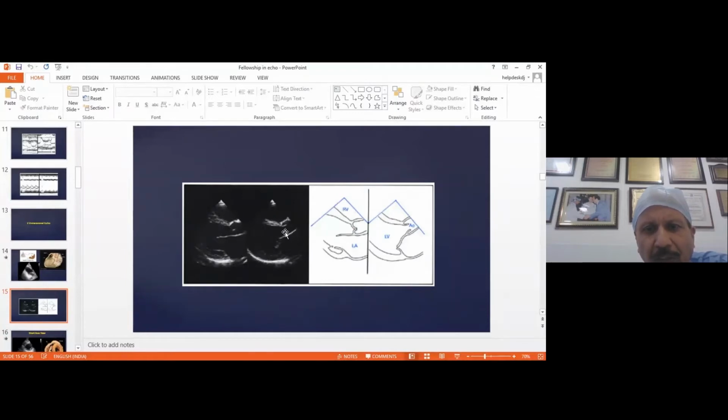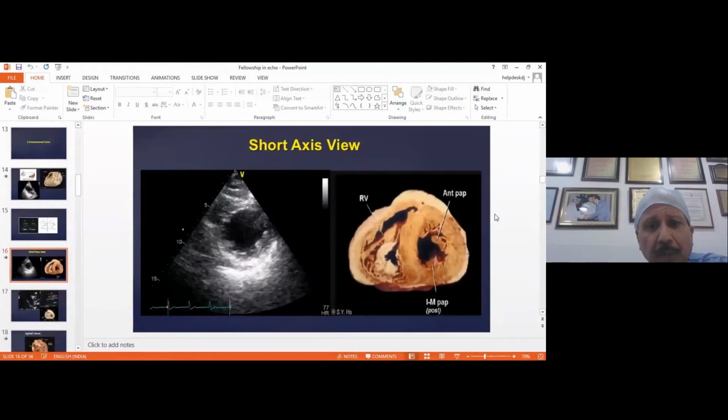You can see the aortic valve open position, and you can see on echo in the opening position. So even though you are seeing a slice of the heart, you're able to perceive that yes, we are able to diagnose conditions by echocardiography. And this was a huge change. It was a change beyond belief.